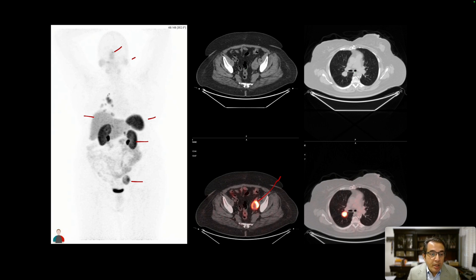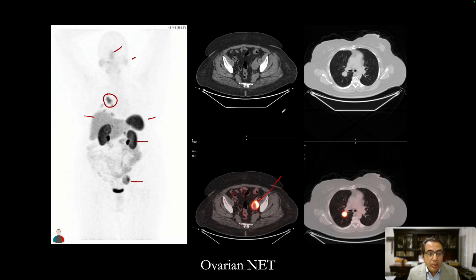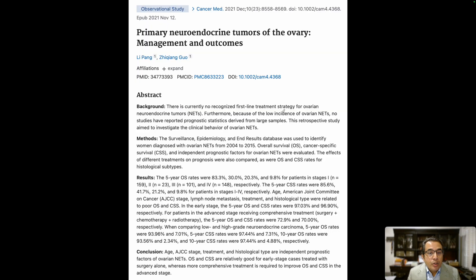Also, this patient has now developed lung metastases. This is a great example of how DOTATATE PET-CT was helpful in whole-body staging in a patient with a very rare ovarian neuroendocrine tumor. A good related article is: 'Primary Neuroendocrine Tumors of the Ovary: Management and Outcomes.'